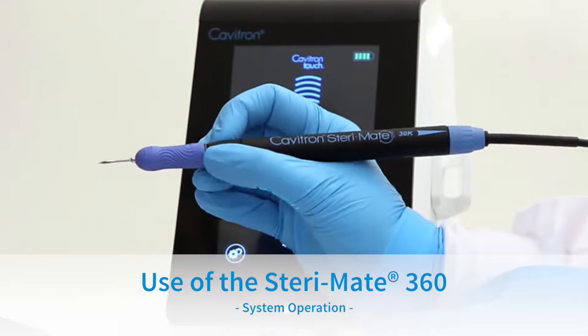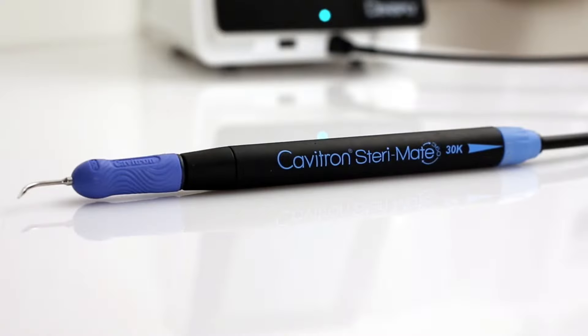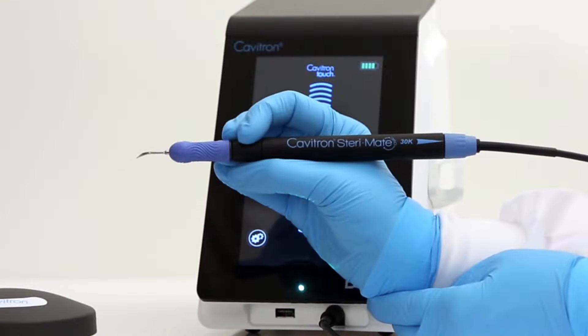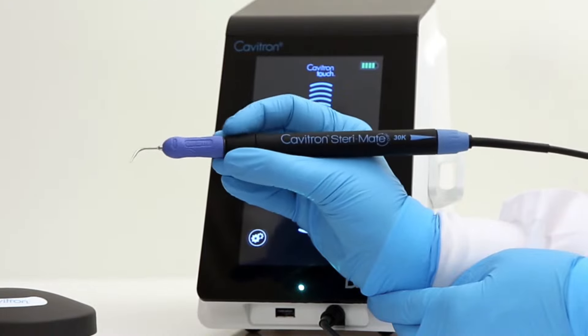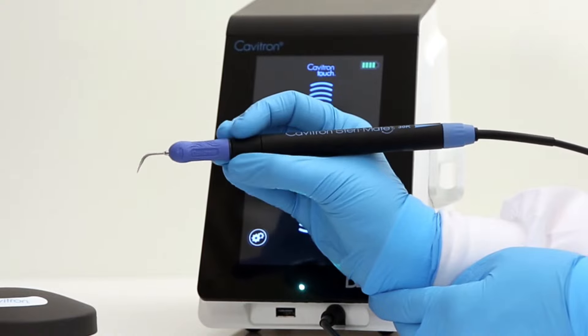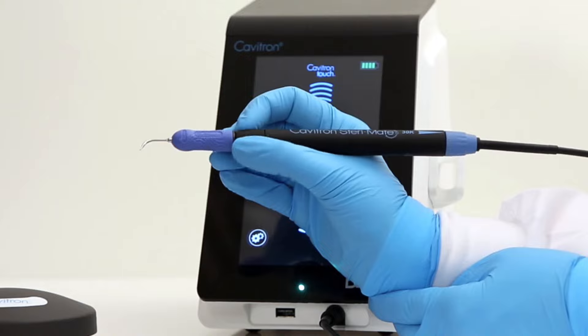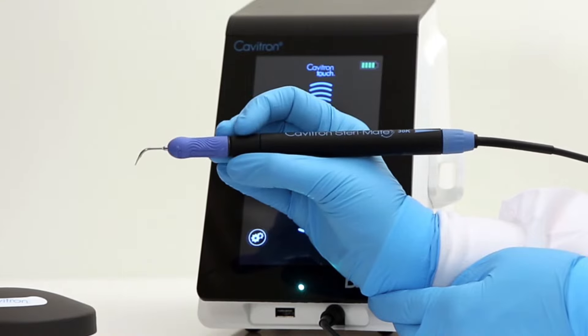Use of the SteriMate 360. The exclusive SteriMate 360 swivel handpiece allows the clinician to fully rotate and insert, and also allows adjustable hand positioning with free-flowing movement, providing ergonomic benefits. The SteriMate 360 provides the clinician with access within the entire oral cavity.